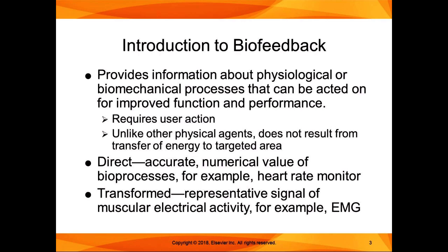So biofeedback can either be direct or transformed. Direct is an accurate numerical value of bioprocesses. For example, a heart rate monitor. That's a great example of biofeedback. You can use that in the clinic. You can tell someone, I want you to keep your heart rate above 100 beats per minute, and they can use that heart rate monitor for direct biofeedback. They see that it drops down, they have to increase their energy output in order to keep their heart rate up. A transformed biofeedback application is something that creates a representative signal of muscular electrical activity.